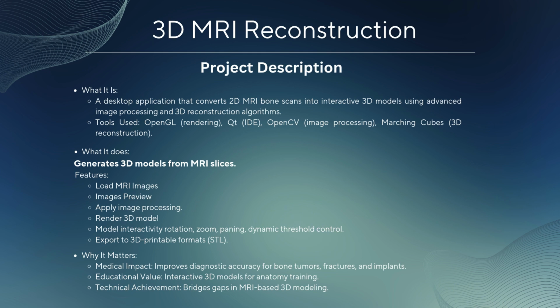So why does my project matter? It matters because it gives a medical impact such as improving the diagnostic accuracy for bone tumors, fractures, and also implants. It also gives an educational value by providing interactive 3D models for anatomy training. And it also offers a technical achievement by bridging the gaps in MRI based 3D modeling.